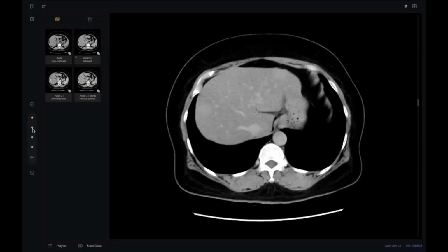What is the name of the contrast? I think I'm dealing with focal nodular hyperplasia. Fourth phase, and which contrast should I request for MRI? Primovist, a hepatobiliary specific agent.